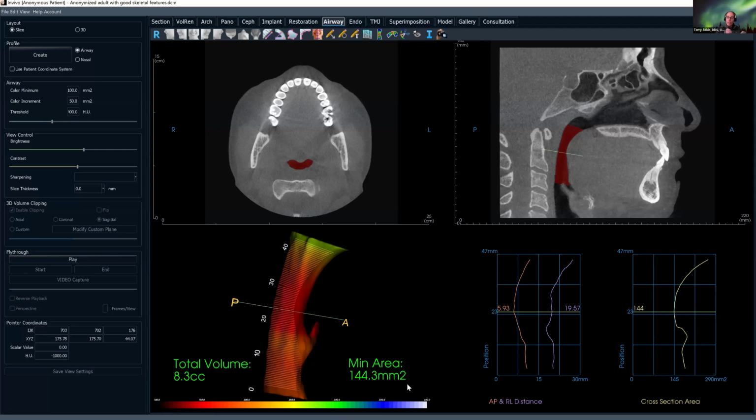What does that mean? But more importantly, I look for the anatomic structures that could be impeding airflow, especially in kids: enlarged adenoids, enlarged tonsils. Sometimes they literally almost are closing that airway. I look at the nasal passage, those nasal valves. Are those narrow? So I look at those equally to this number right here.